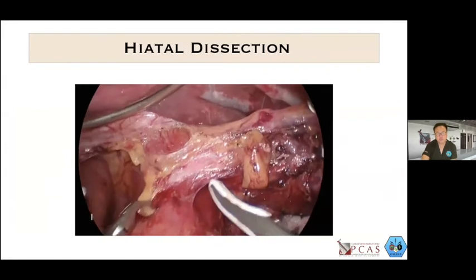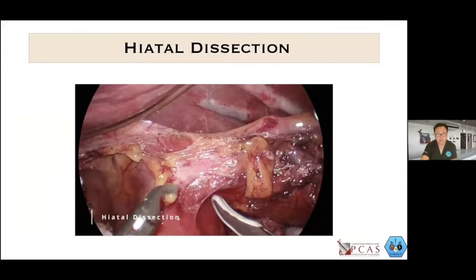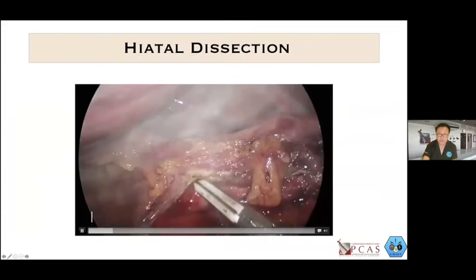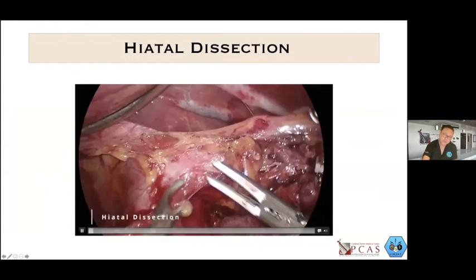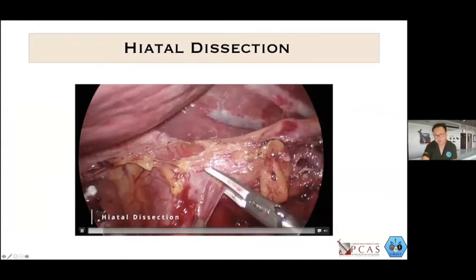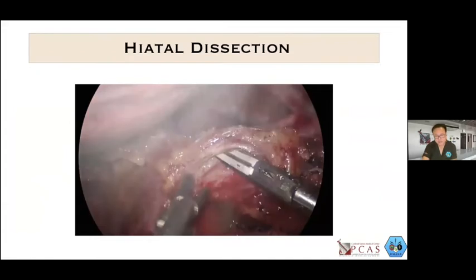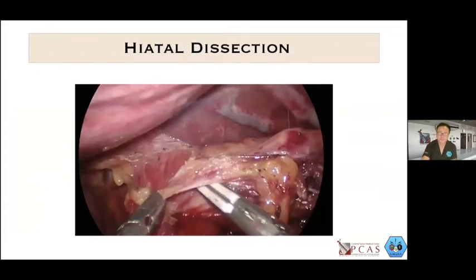So just to show you how we do it, you can make use of a Penrose drain rather than holding it with an instrument here. This is now your esophagus. The assistant is holding the gastric area. I think this is for gastric cancer. I'm not sure. It's the fellows who did this. Yes, this is for gastric cancer.